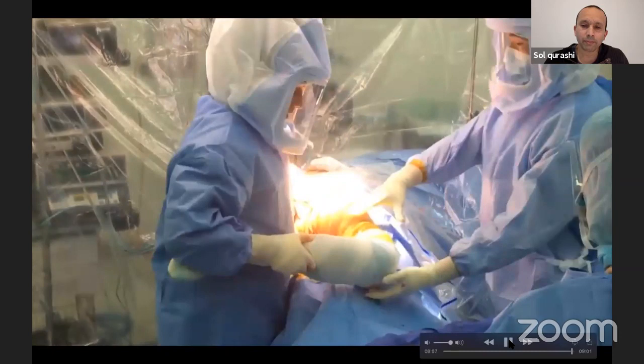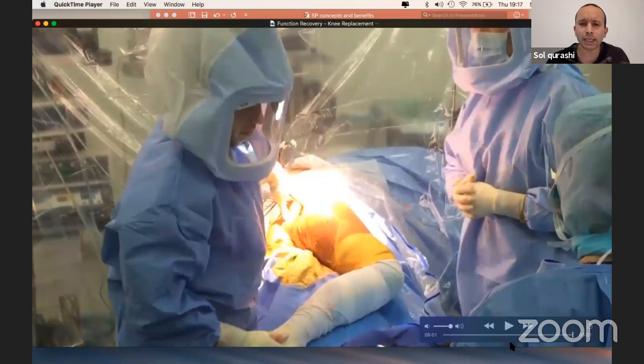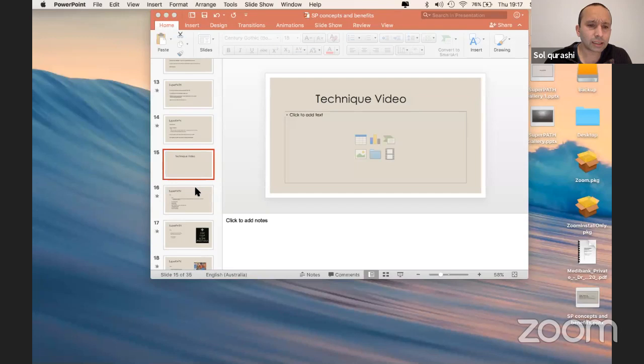So check for shuck in flexion, mid flexion and extension to make sure that the tension is adequate. Usually you allow a little bit of shucking in mid flexion because both anterior and posterior ligaments are slightly lax. But in extension and flexion, you shouldn't have any shuck. So that's what are we up to? That's the technique.